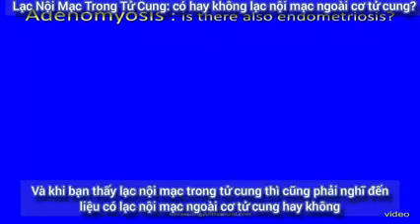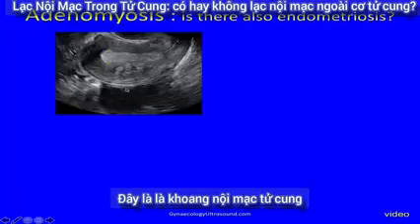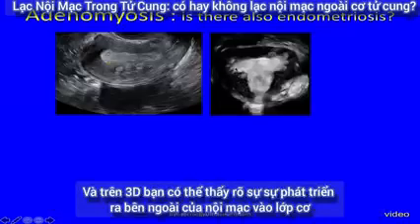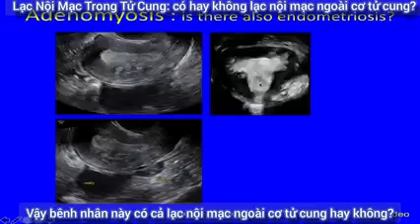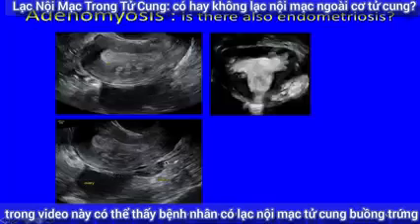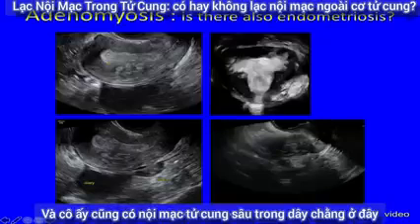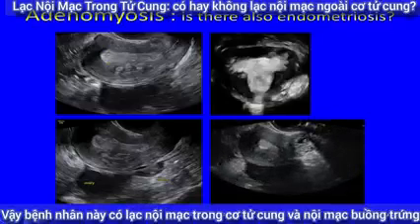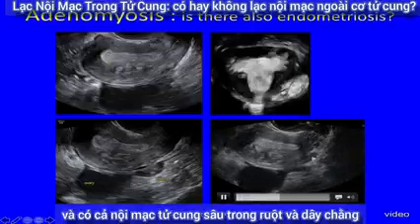When you see adenomyosis, you have to think — is there also endometriosis? In this different case, here is the endometrial cavity with islands of endometrium in the myometrium, and on 3D you can clearly see this out-budding of endometrium into the myometrium. Does this patient also have endometriosis? In the video clip you can see she has an ovarian endometrioma, a nodule of deep endometriosis in the bowel, and deep endometriosis in the ligaments — so adenomyosis in the myometrium, ovarian endometrioma, and deep endometriosis in the bowel and in the ligaments.